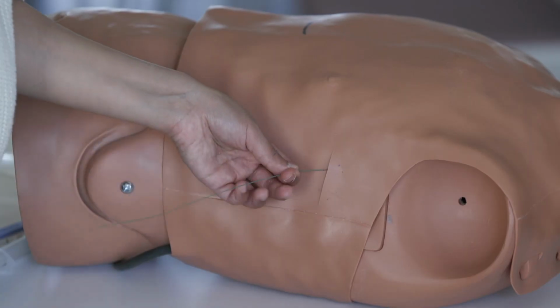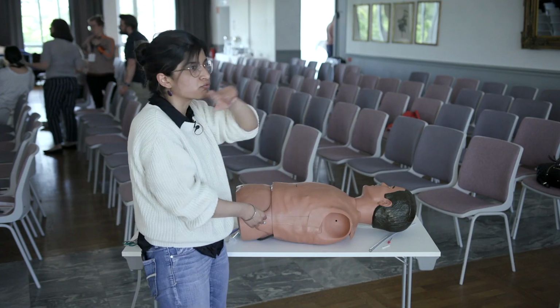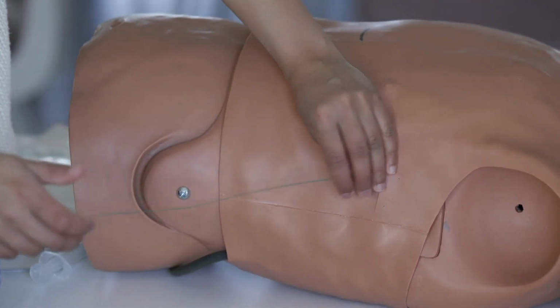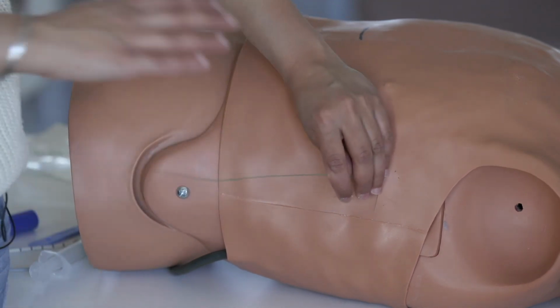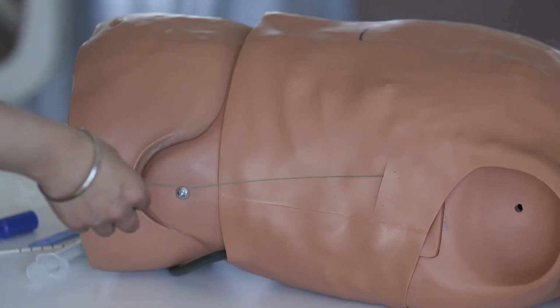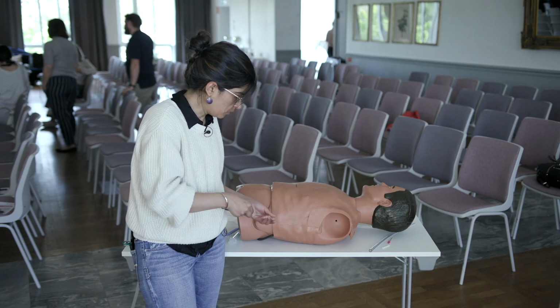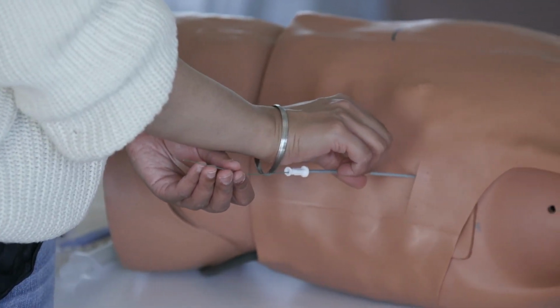Okay. So now this being the Seldinger technique, right? Everything is on a railroad. So this is your railroad, right? You will always have plenty of wire in a patient like this. So you're not too worried about it migrating in, but still be mindful of how much is out. And then everything from this point on depends on the integrity of your wire, right? So you load the dilator on, and then same thing as any other Seldinger technique, right?